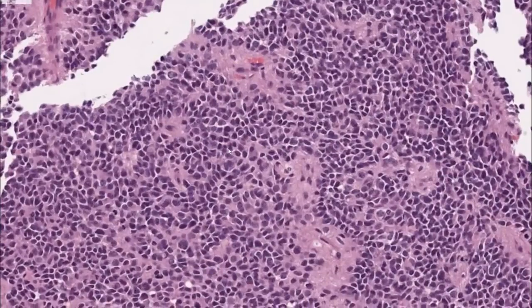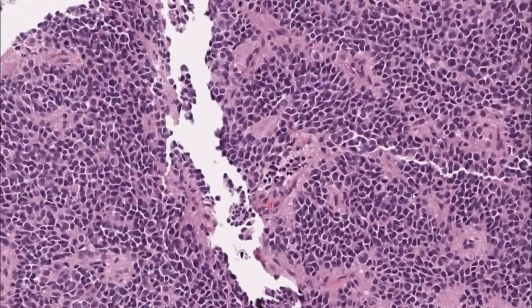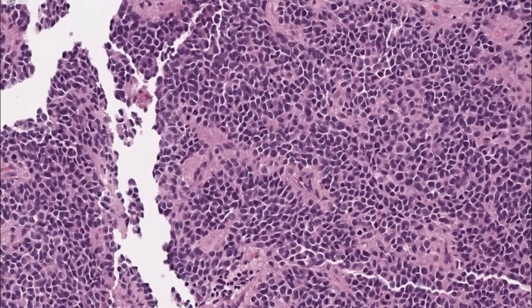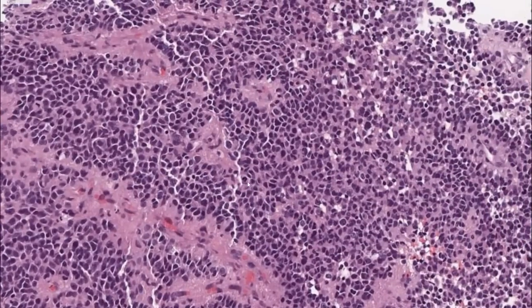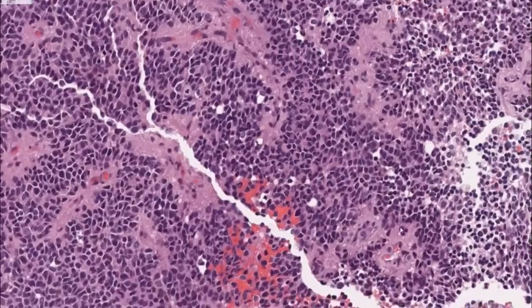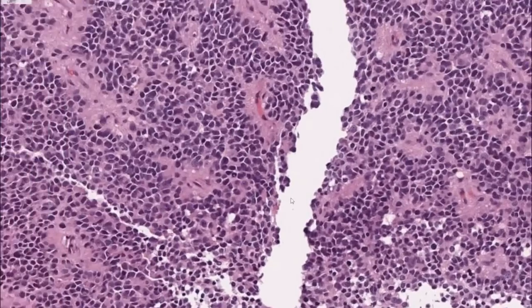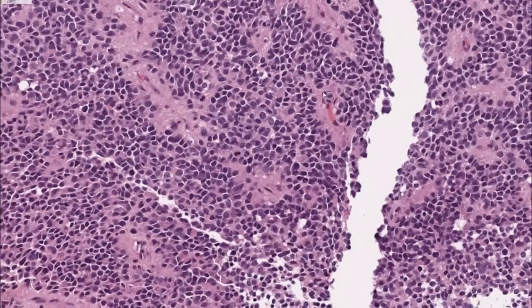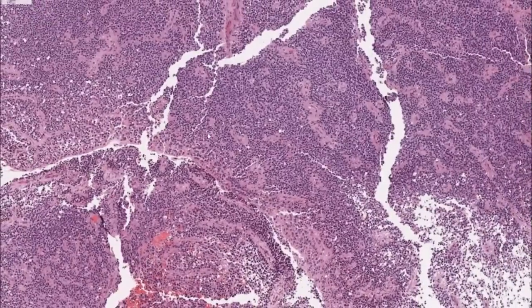Now, if you go on high power, it's very blue, and you start seeing also brisk mitotic activity. Pretty much, they're not difficult to find. You see them in many different fields, multiple fields with multiple mitoses. That is extremely concerning in an ependymal tumor. Apoptotic bodies, some of them, but mitotic activity is not difficult to find here. Cellular tumor, mitotic figures. So this is anaplastic. It's malignant, independent of what we end up calling it, okay?